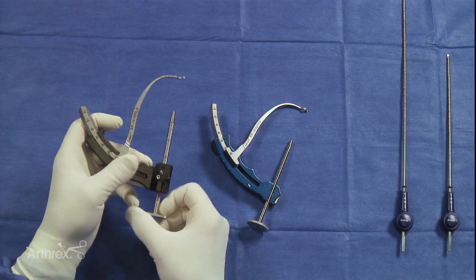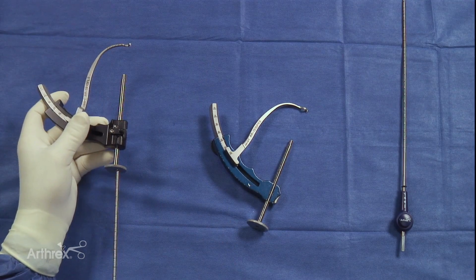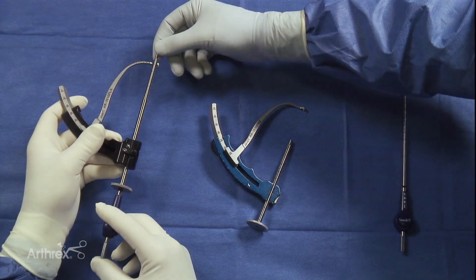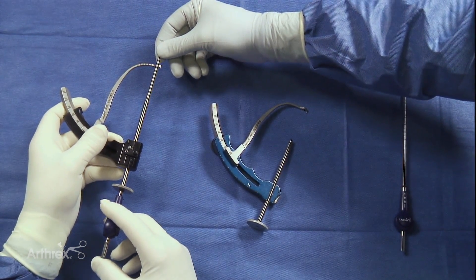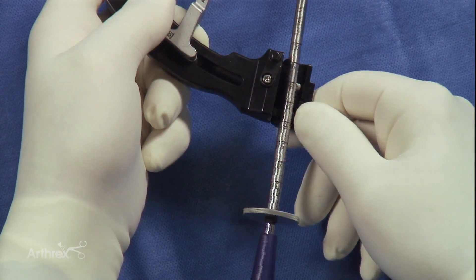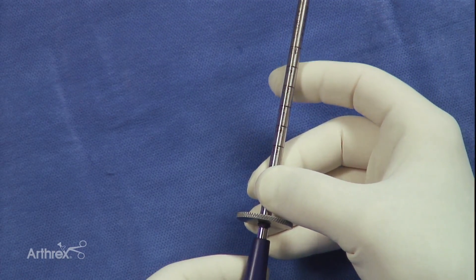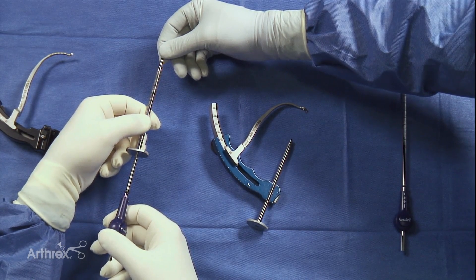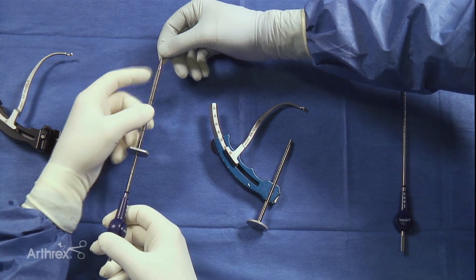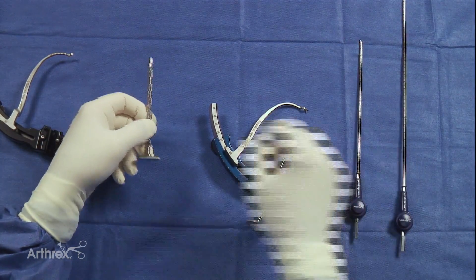Using the newer version of this guide system and the newer version of the flip cutter — the shorter flip cutter — we can now drill through the guide, secure it in bone, and simply flip this lever and release it without having to slide the sheath back down and off. Then we can advance that in position, implant it into the cortex again with the seven millimeter step-off.